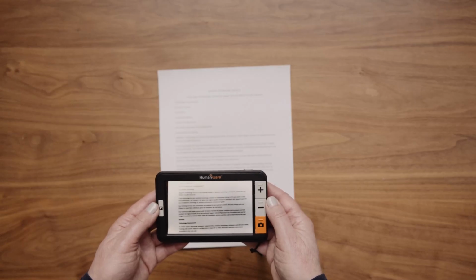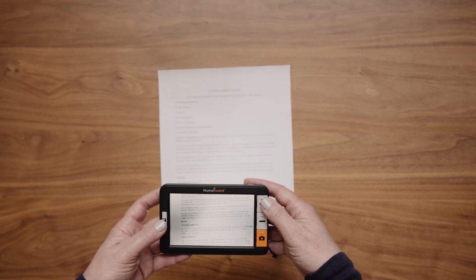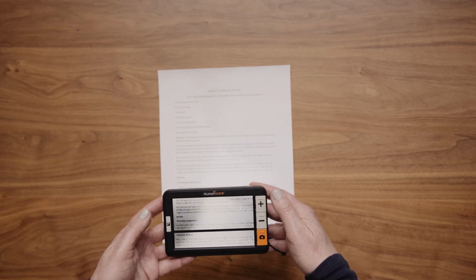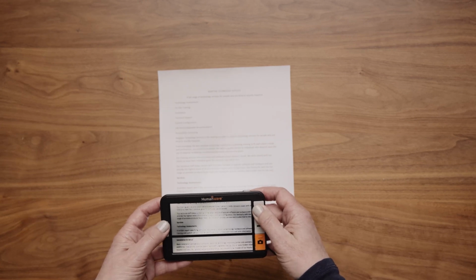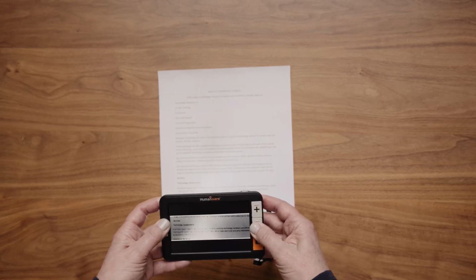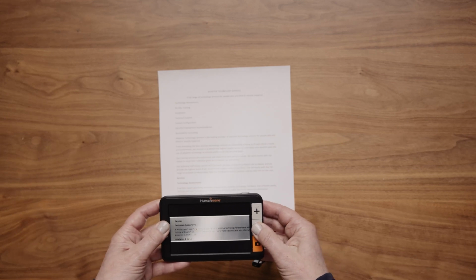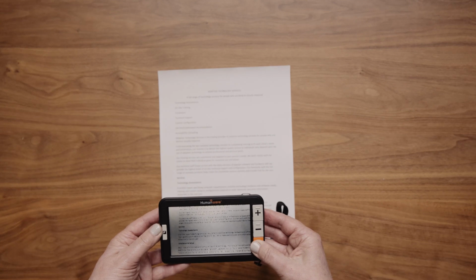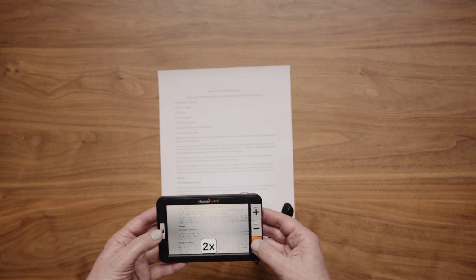Summary. Turn on or off the line feature. Press contrast and Zoom In plus buttons simultaneously. Turn on or off the blinds feature. Press contrast and Zoom Out minus buttons simultaneously. Freeze an image. Press the freeze button. Save an image. Press and hold the freeze button.